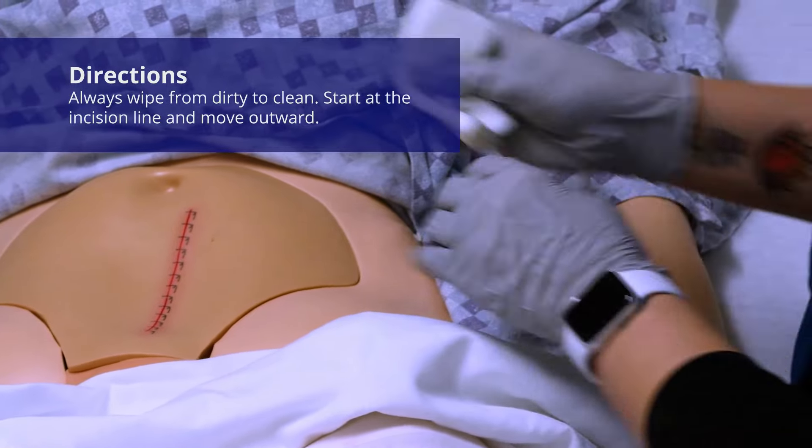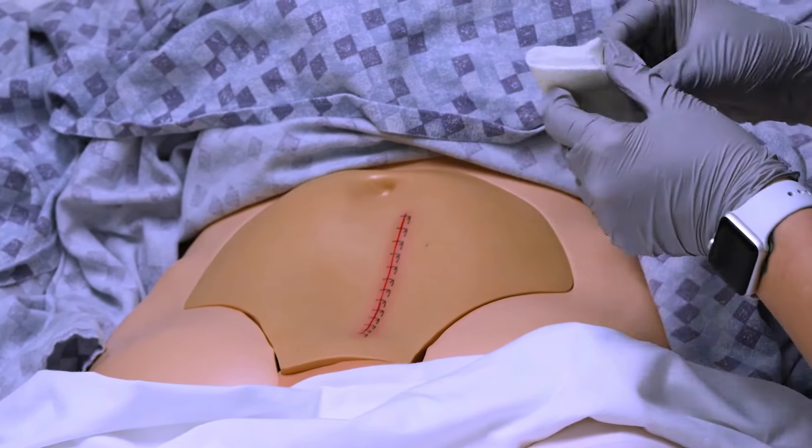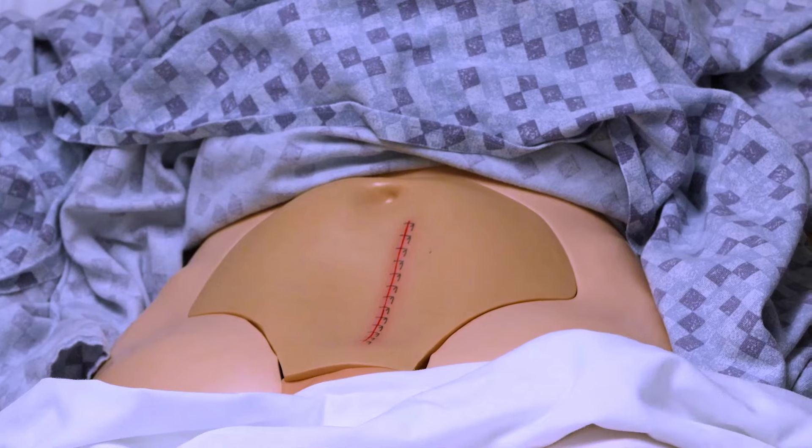If this was a fresh gauze, I could also come this way and clean out, and then use a new surface and clean out. So either one of those approaches is pretty okay to do.